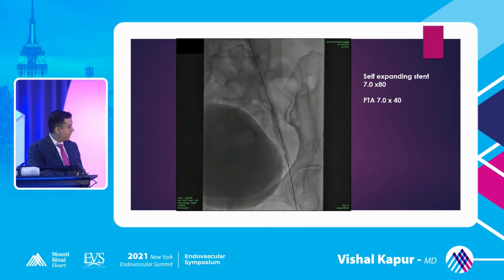Is the patient complaining of pain at this time? No pain. She's completely stable all throughout, before and after the complication. So how did you size your stent? It wasn't IVUS because I didn't do it. It was just more a visual assessment, saying, okay, external iliac, self-expanding. So, yes, go ahead. Oh, I thought you had a question.